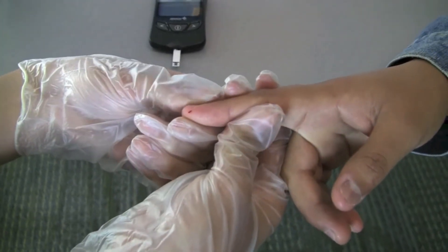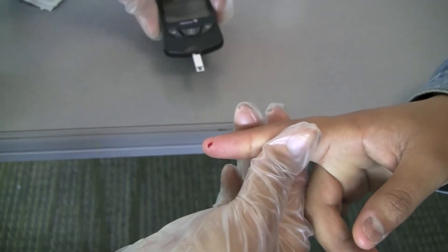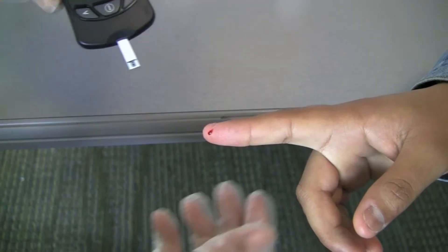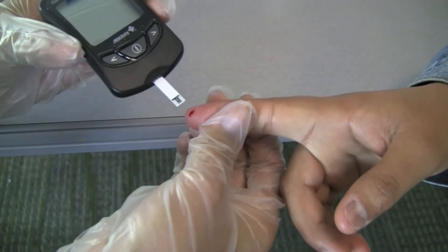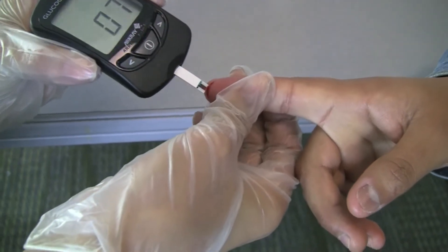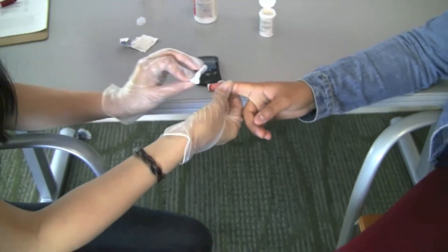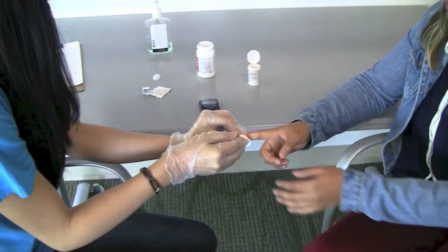When a drop of blood is formed, put the tip of the test strip close enough to the drop of blood to allow the test strip to be filled with blood. To obtain more blood, you can gently massage the area. Place a cotton swab on the area that was punctured and have the patient hold it there until the bleeding stops.